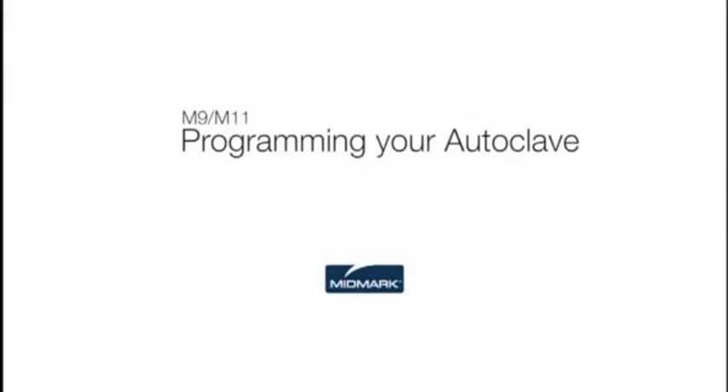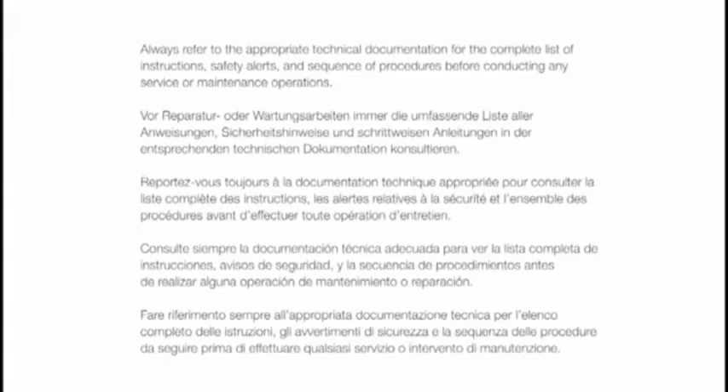This video is an overview of how to program your autoclave. However, always refer to the appropriate technical documentation for the complete list of instructions, safety alerts, and sequence of procedures before conducting any service or maintenance operations.